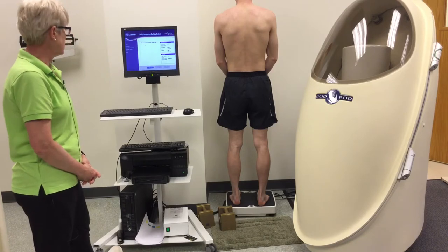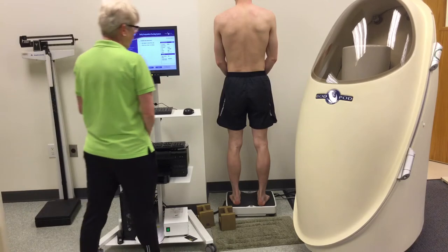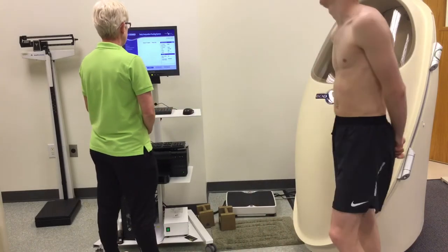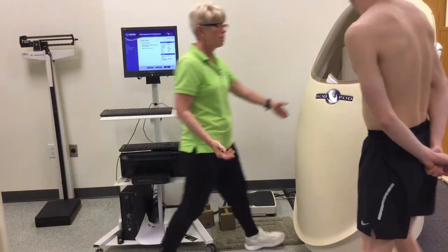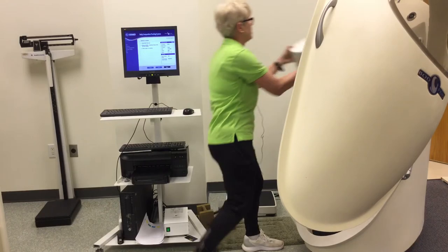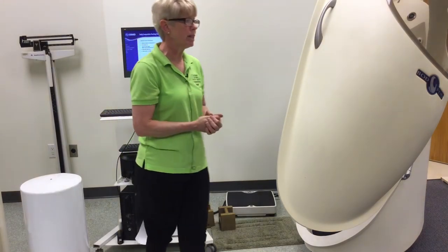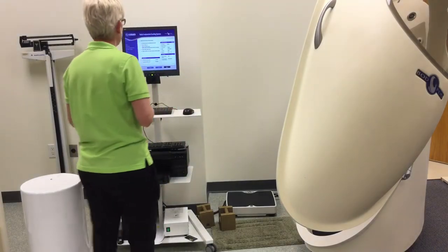It's really important that your subject stands as still as possible. You can step off. Once they're off, you wait for the next button to show up. It's clearing out the scale one more time. Now it's going to tell me to open up the bod pod door, take out the cylinder, and click next. It's going to make sure one more time your subject is wearing the appropriate head cap as well as having the appropriate clothing on.